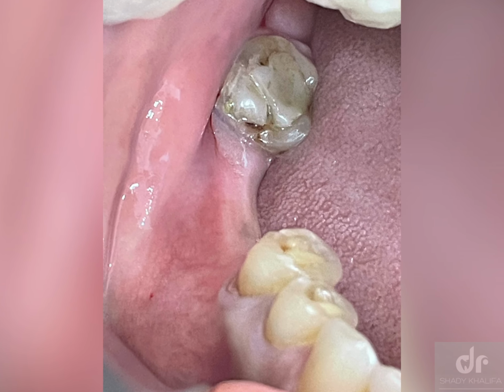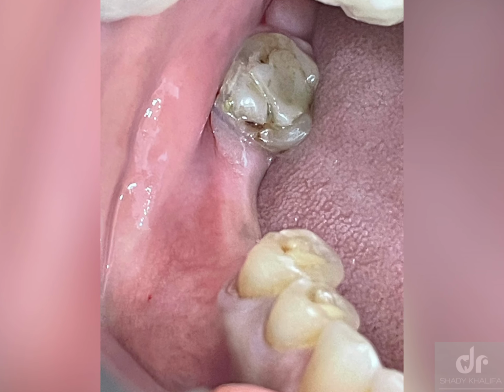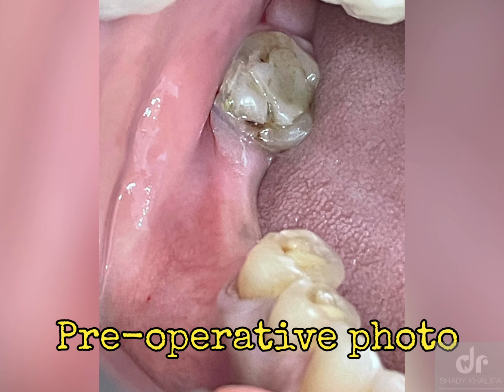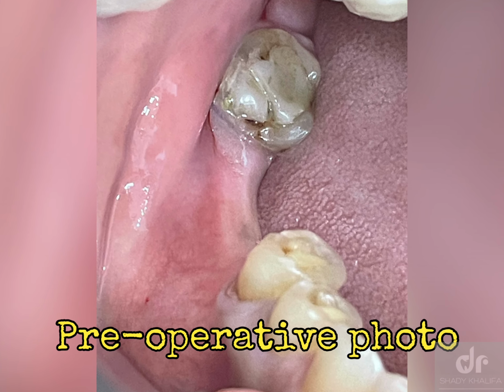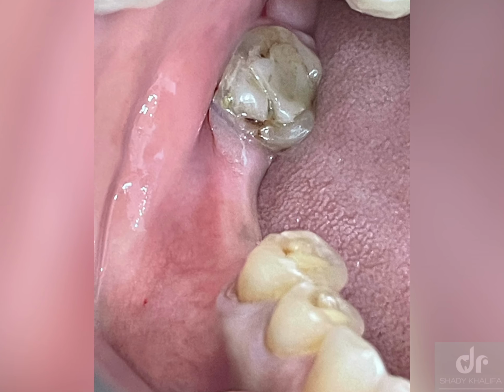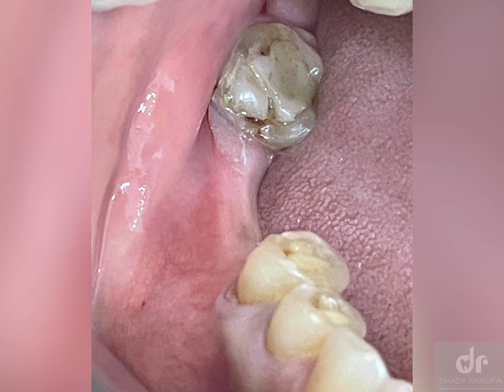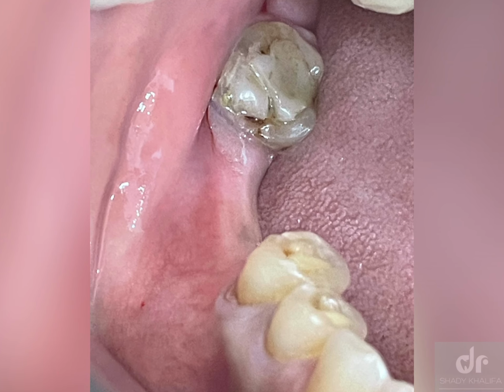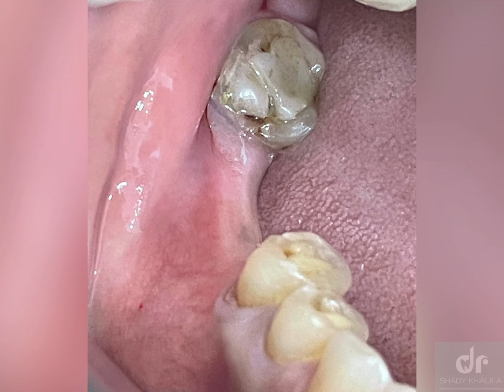Here we have a pre-operative photograph that was taken from the side. We estimate the buccolingual width. Actually, we can take a CBCT, cone beam computed tomography, radiograph to measure exactly the buccolingual width in addition to height.